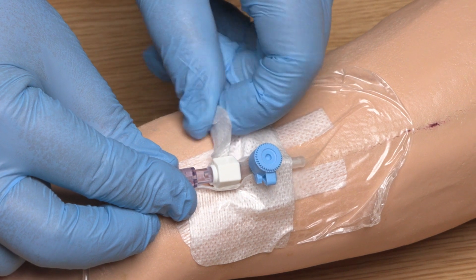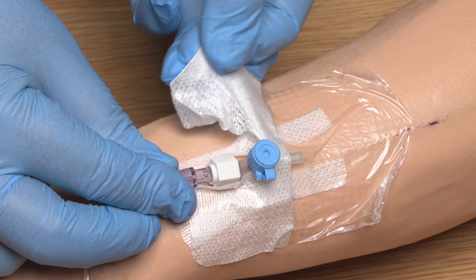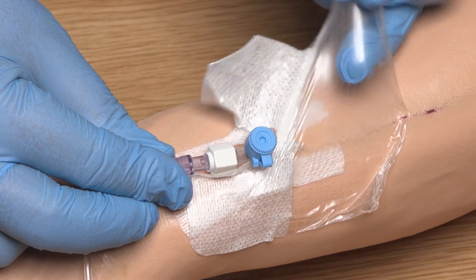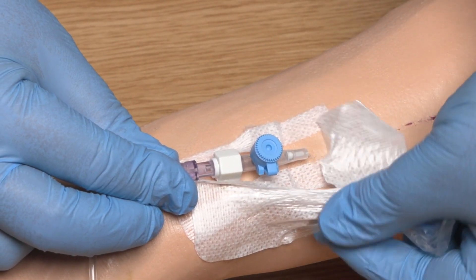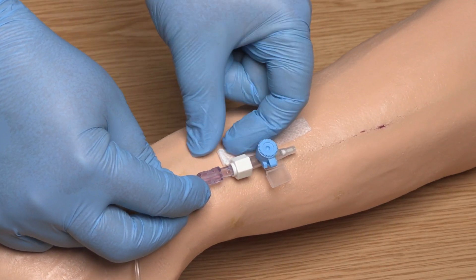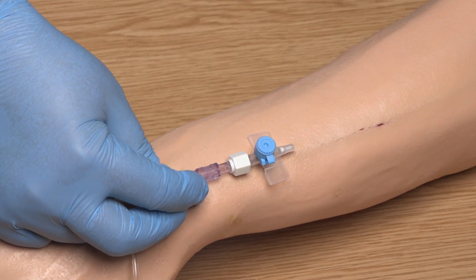I'm now going to remove the PVC dressing. You can see that I'm picking up the edge of the dressing, stretching it and drawing it away from the skin in an upwards direction towards the insertion site. This will minimise the risk of the PVC being accidentally dislodged.